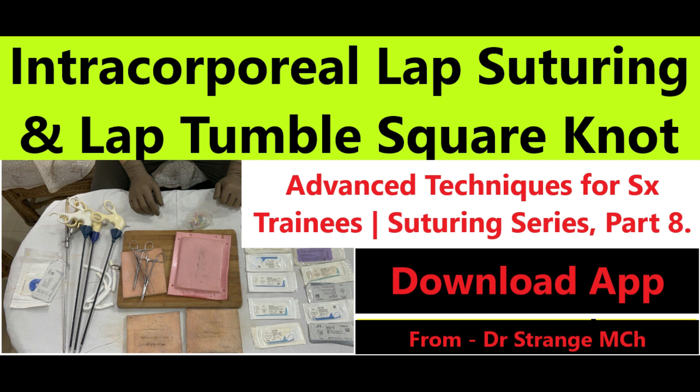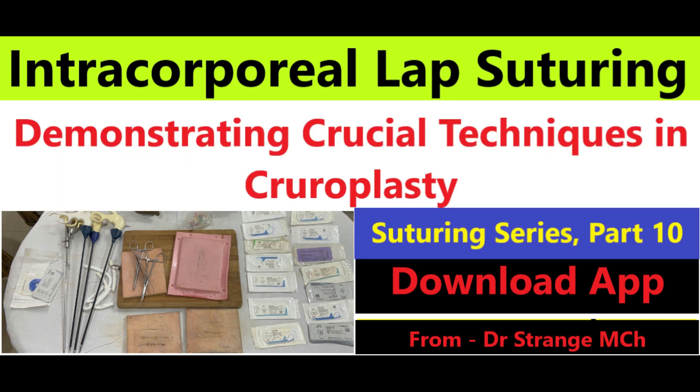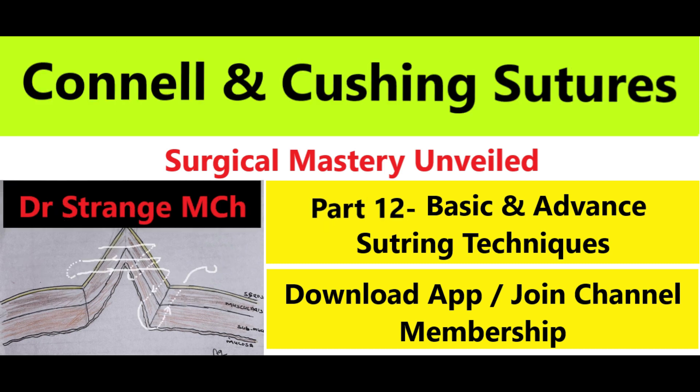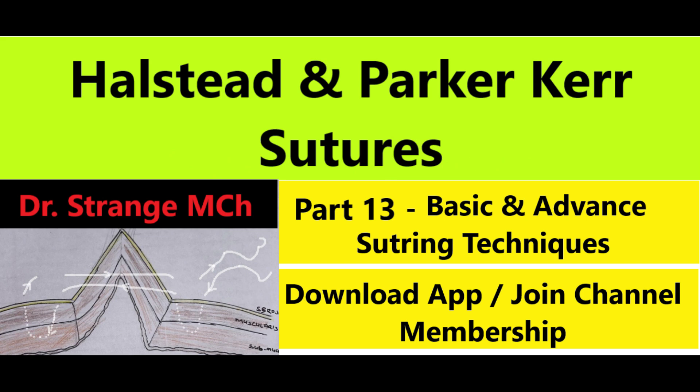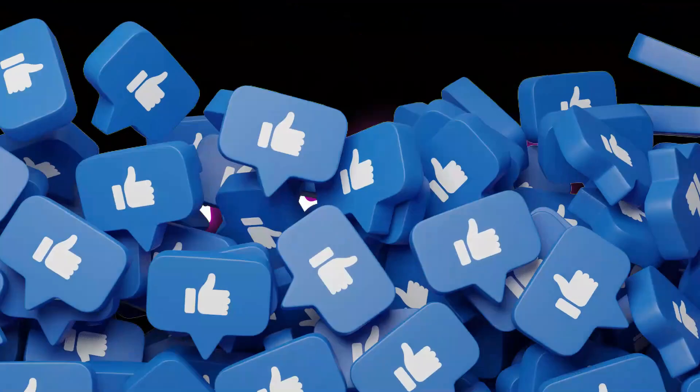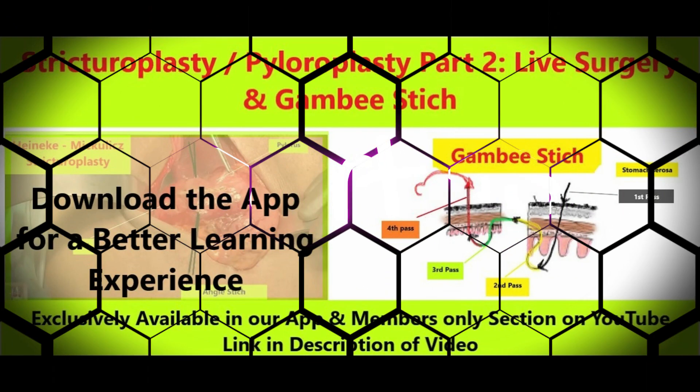I'll walk you through each step of the Gambee stitch, from needle placement to knot tying. You will learn the ins and outs of this technique and why it is a must-know for any surgical training. By the end of this episode, you will be able to perform the Gambee stitch with competence, adding another essential tool to your surgical toolkit.